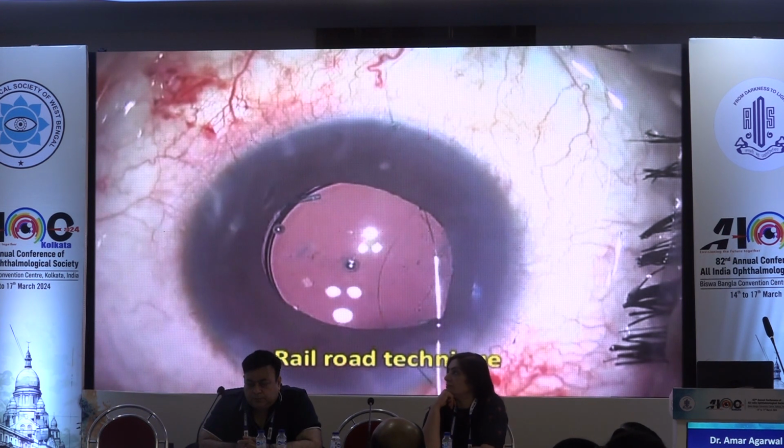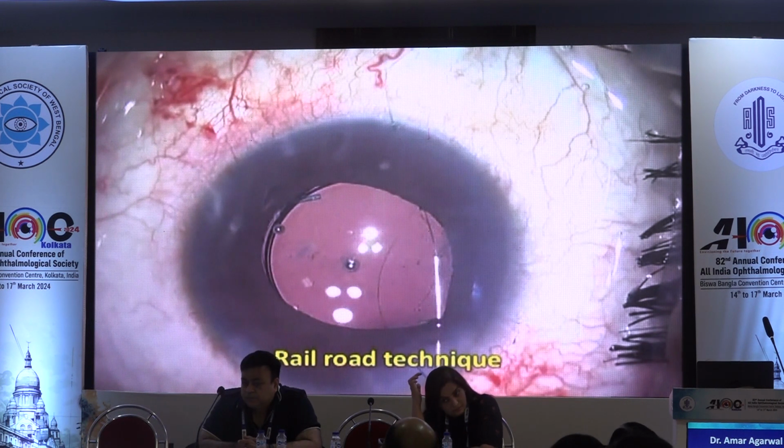So I called up one man who is a guru of all, Jack Holiday. I told him straight, Jack, this is my concept, I'm doing this, but I tell you honestly, there is no way I'll take it to another level. And I'm not joking, since then till today, he is with us every time. So with him we designed this Holiday pinhole device.